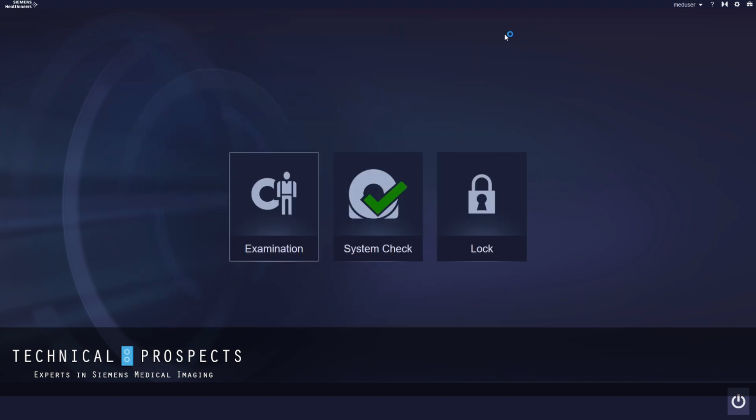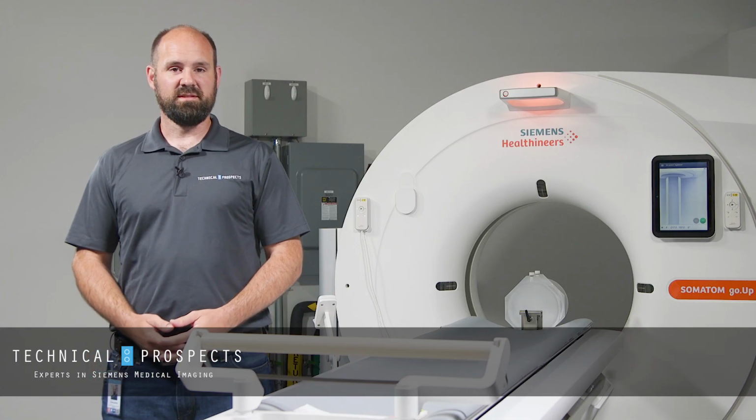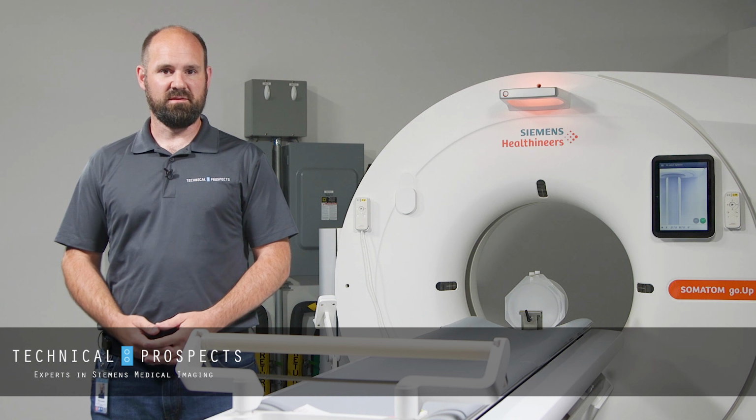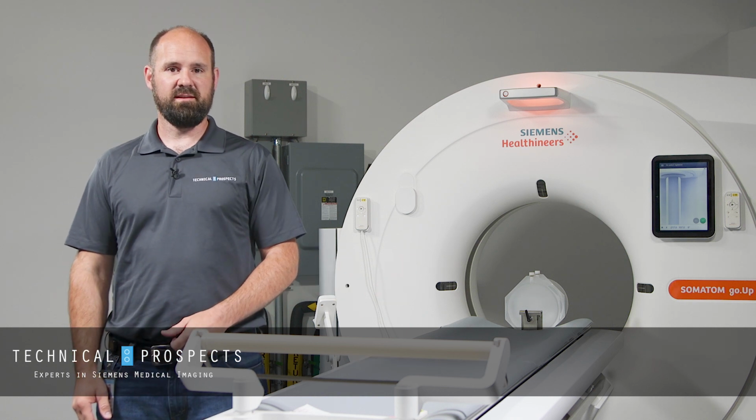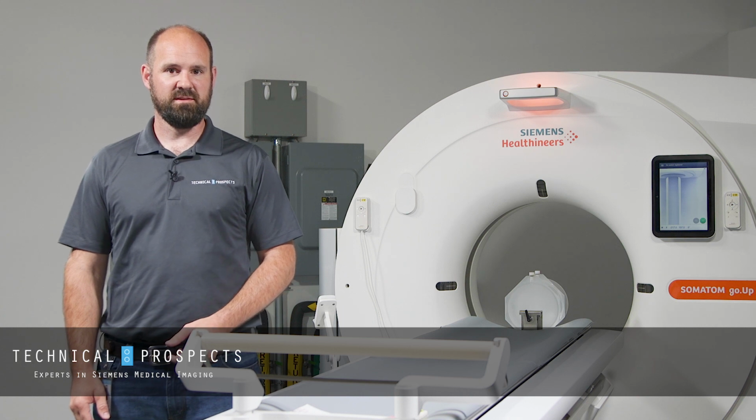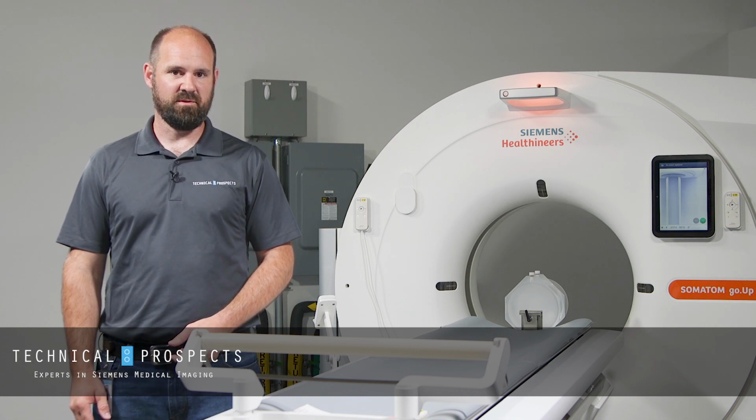Whether you're a seasoned expert or just getting started in medical imaging service, this series on the SOMATOM Go and Syngo Native is designed to elevate your comfort and knowledge of the platform.